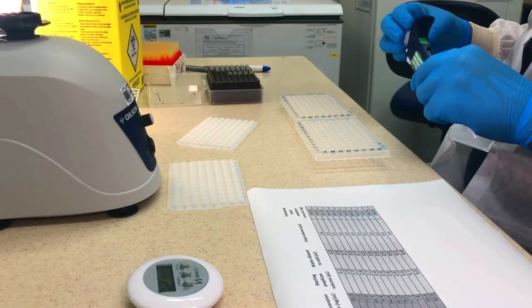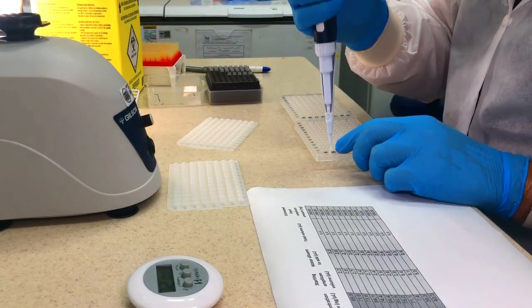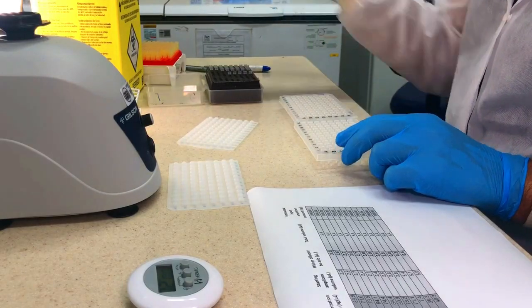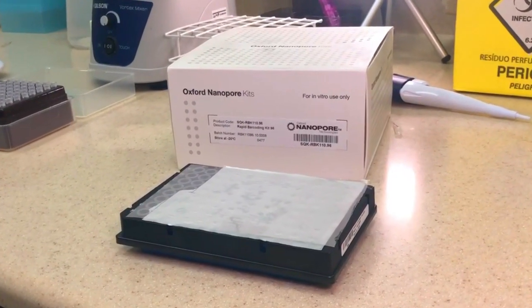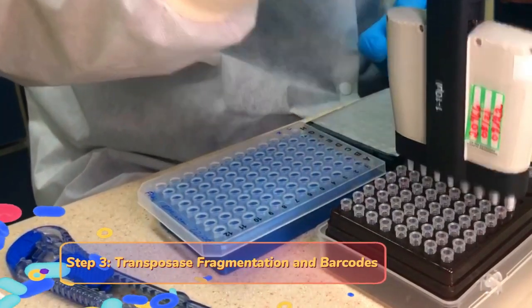Omixon provides a workbook to help the user during the whole process. This workbook helps us dilute the DNA to a concentration of 20 nanograms per microliter and to dilute the amplicon to a concentration of 200 nanograms. You can do that by mixing the amplicon with water according to the workbook calculation.